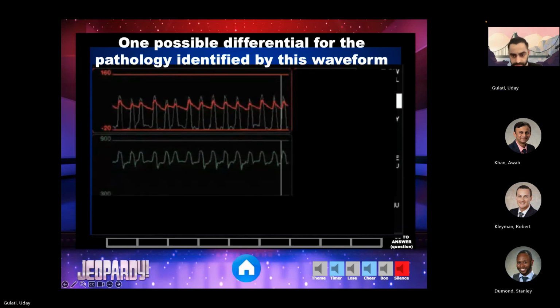Again, he's talking about the negative deflection in the motor current, but look at the other waveforms. Some waveforms have tall peaks in your ventricular flow, and others look like what you would see with pulse pressure variation. The reason he said diastolic suction alarms is this: you see the little waveform come up in diastole, which is different from continuous suction alarms. You almost see pulse pressure variation.